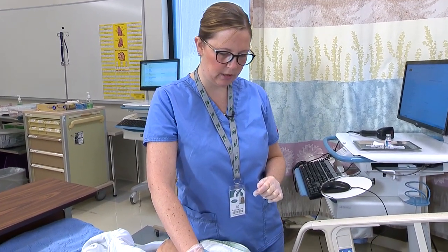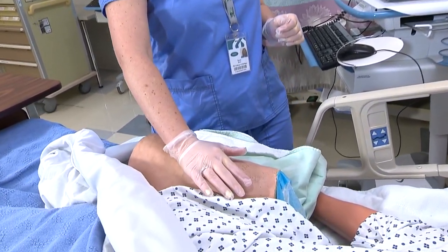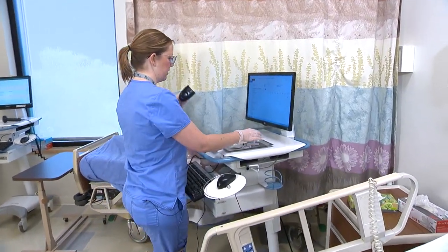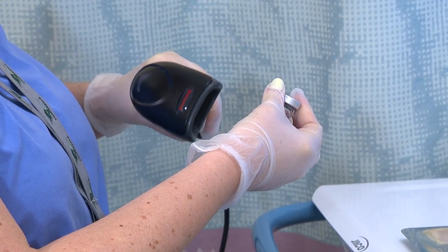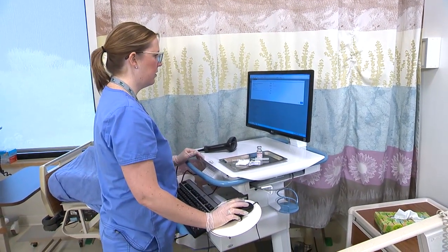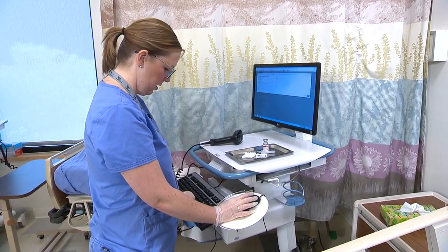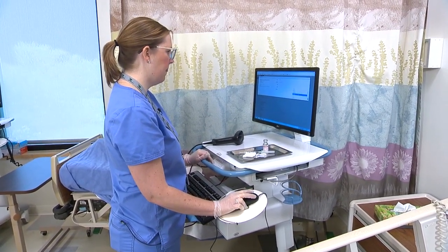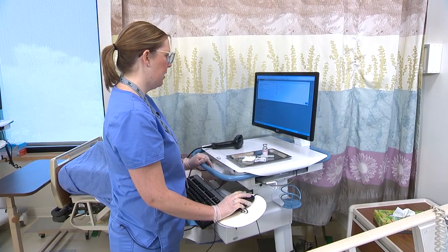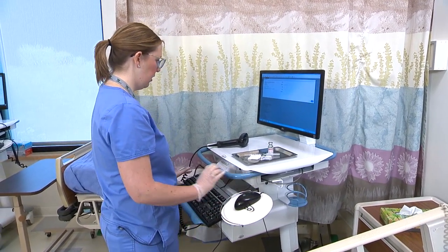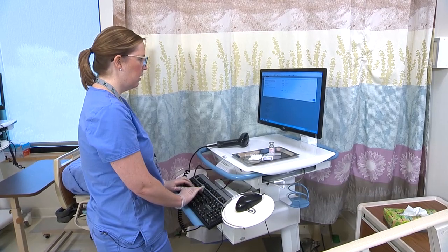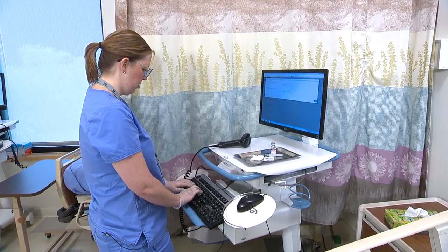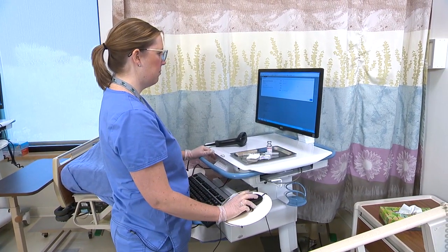I have my markings here so you can see. First I'm going to scan the patient, then scan the medication. I need to fill in my fields — my dose is 0.5 mL. In the comment section I'll document: given in right ventrogluteal. Then click submit.